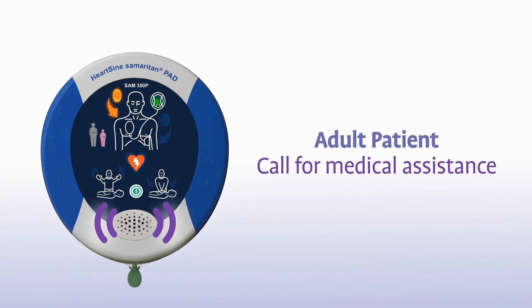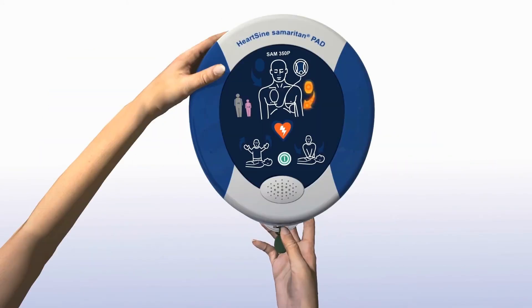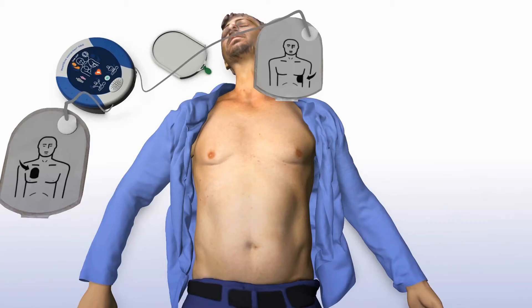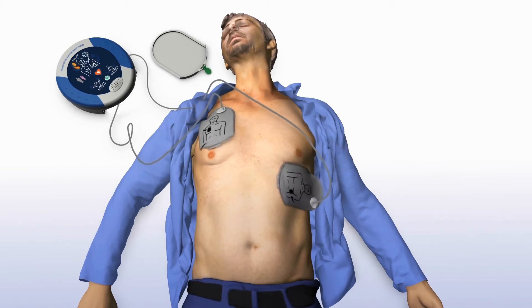You will hear the prompt: 'Adult patient. Call for medical assistance.' Remove clothing from the patient's chest to expose bare skin. Pull the green tab to remove pads, then peel pads from the liner. Apply pads to the patient's bare chest as shown in the picture and press pads firmly to the patient's bare skin.